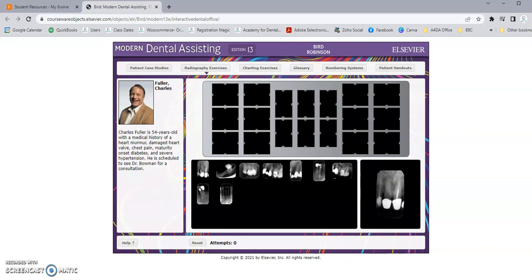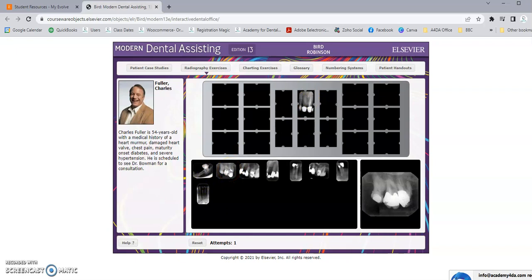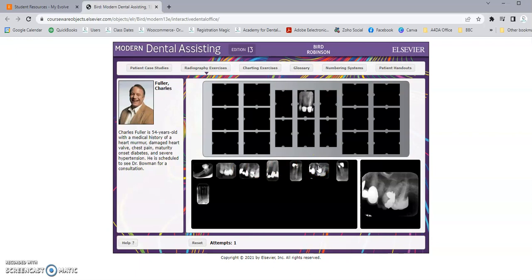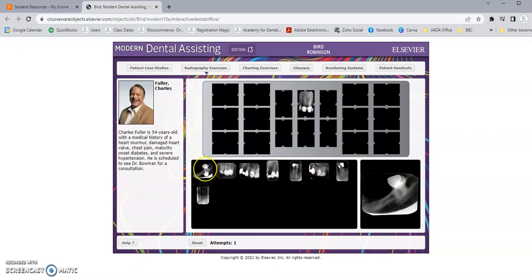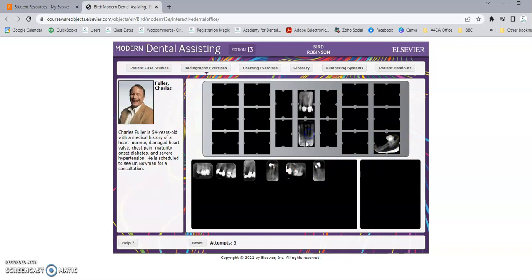I can tell that it's a single root and it looks like teeth 8 and 9, so I want to try and visualize the teeth. If I think this is a PA of 8 and 9, I'd try to put it there — and again, if it stays there, it's in the right spot. Remember, molars have two roots on the mandibular and three roots on the maxillary. You can't always see the three roots on the maxillary, but on the mandibular you can definitely see two roots. In the maxillary, you can sometimes see a white sinus line. This PA shows that white line at the top is the sinus, so this is a molar tooth — it's going to be either on this side or that side, but I can tell by the curve which side it goes on. This looks like a straight shot of 24 and 25, which will go in that place in the mount.